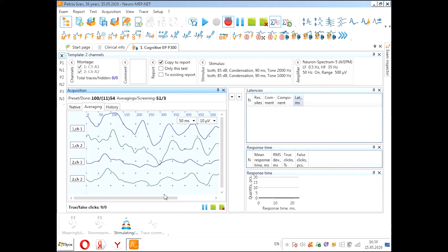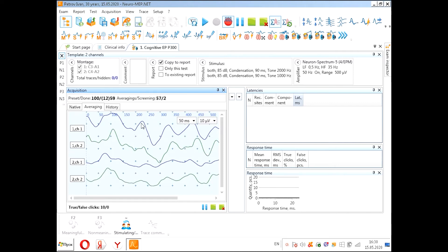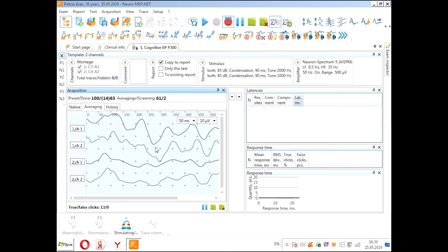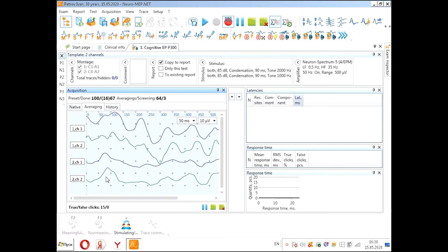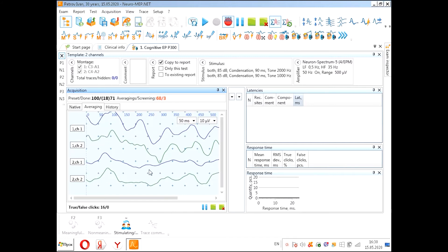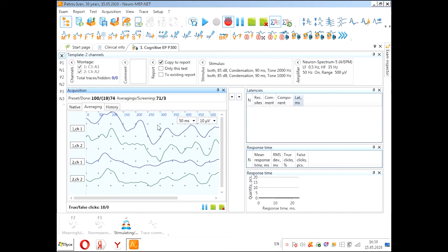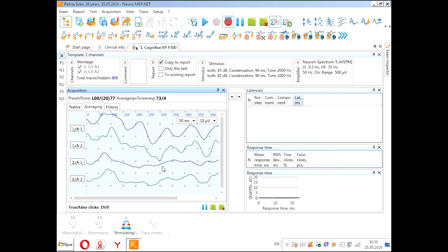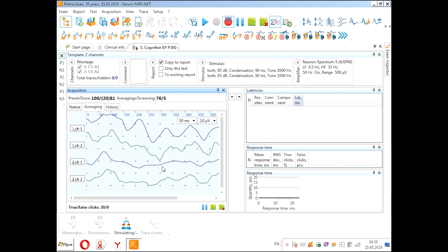We see here that the cognitive complex including N2 and P300 is situated here. And these curves on the non-meaningful stimuli haven't got this complex N2 and P300.